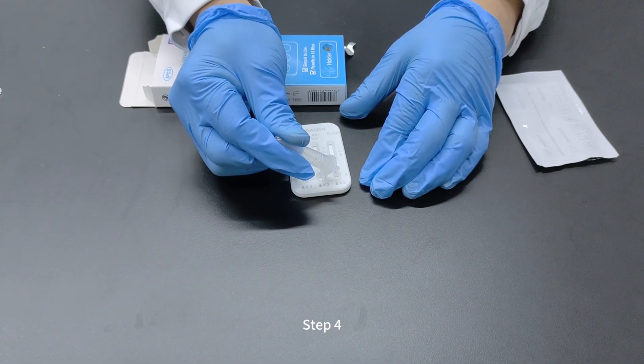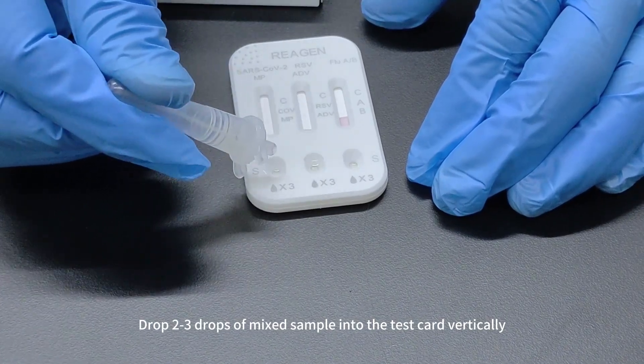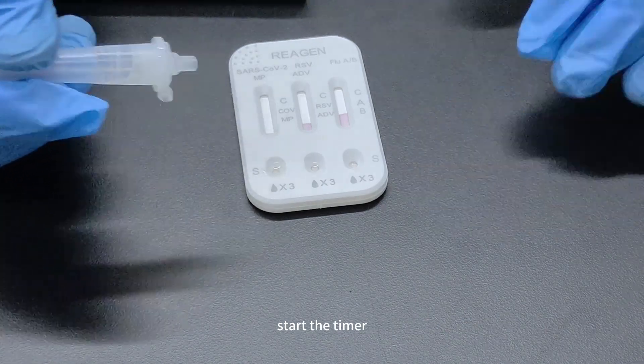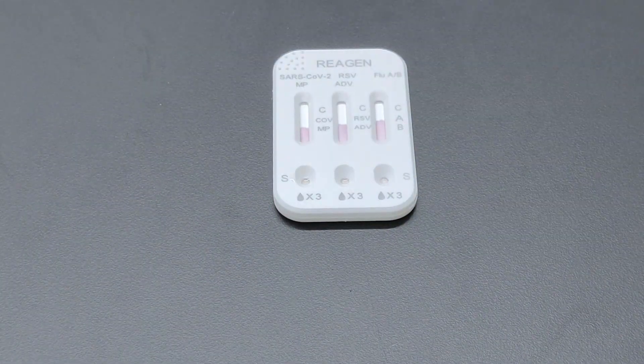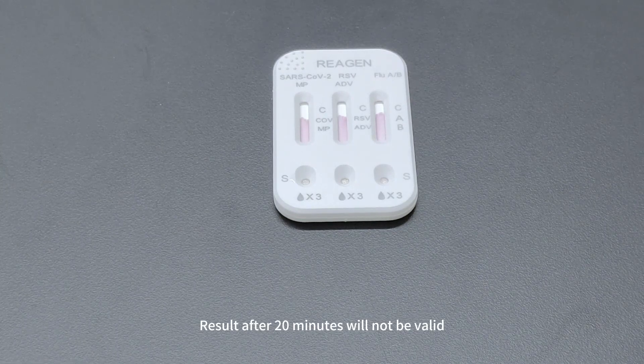Step 4: Drop two to three drops of mixed sample into the test card vertically. Start the timer. Read the result at 15 minutes. Result after 20 minutes will not be valid.